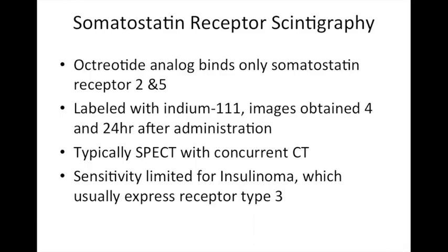All right, so somatostatin receptor scintigraphy. Again, we all know about Octreoscan. Octreoscan uses a somatostatin analog that's labeled with indium-111 and requires SPECT imaging. Typically they give the drug and the images are obtained 4 and 24 hours after, sometimes again at 48 hours, but typically just those first two, and again with SPECT imaging.